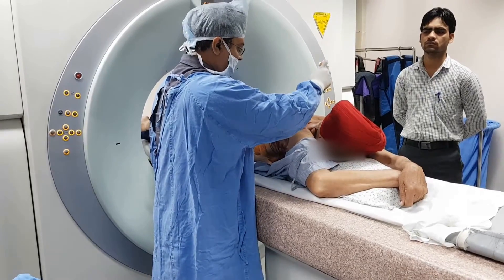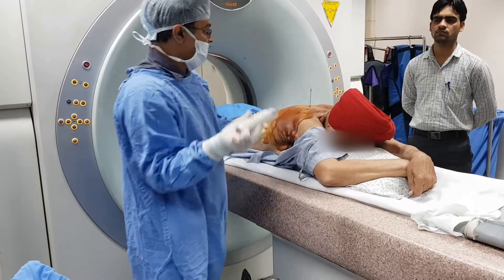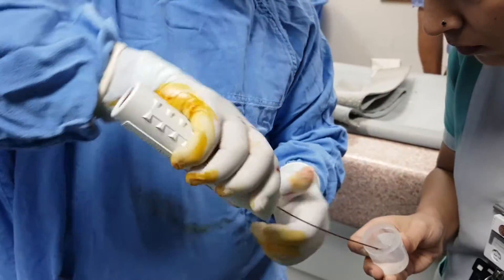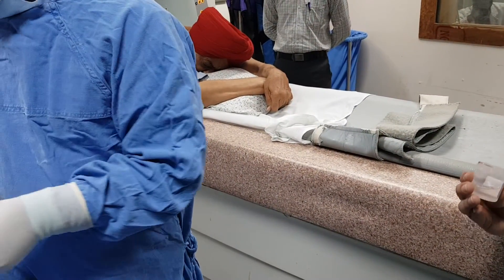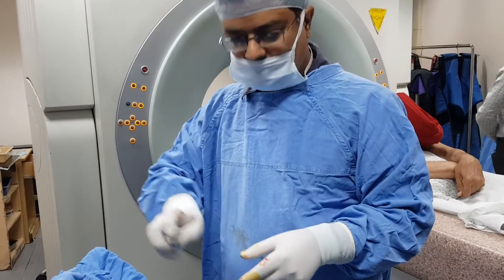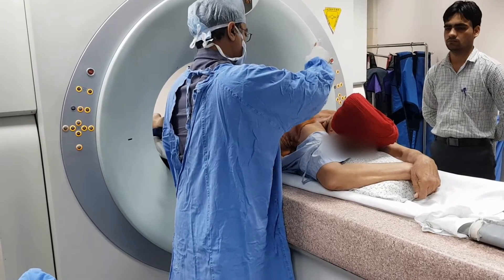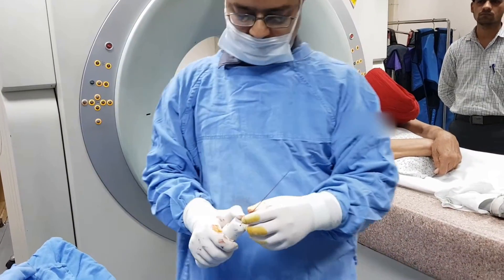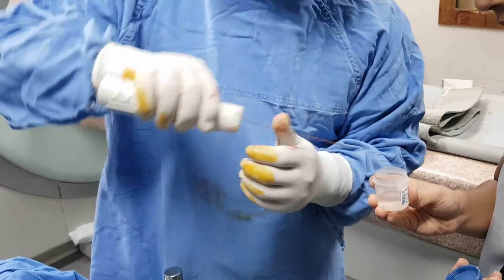Let him breathe and get a little bit of blood. We are not getting good pieces now — the first was good, then the needle bent. I will try to correct it manually. I am bending it too much. You can have a good piece now. The best part of monopty is to take a number of pieces.